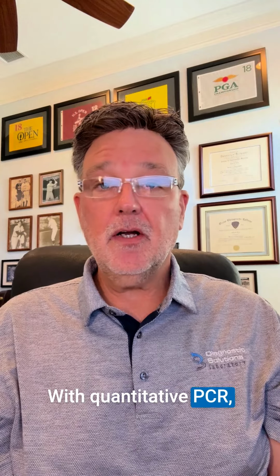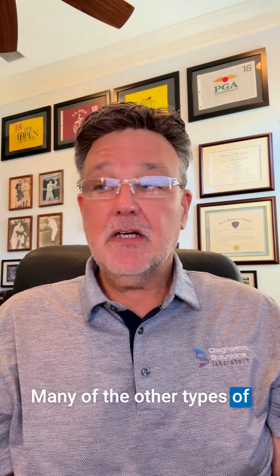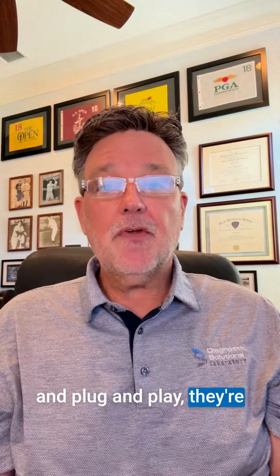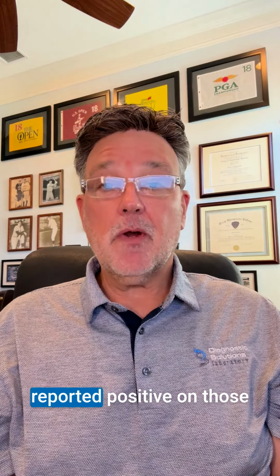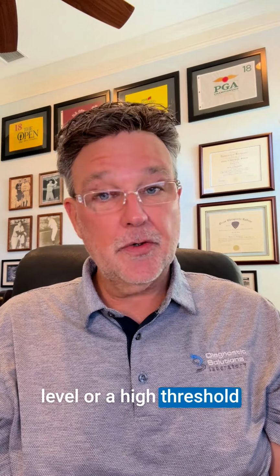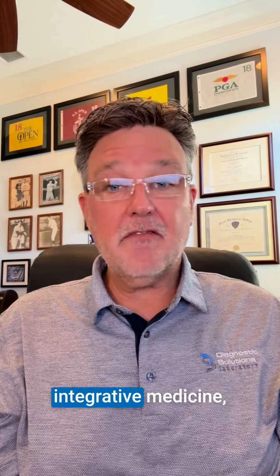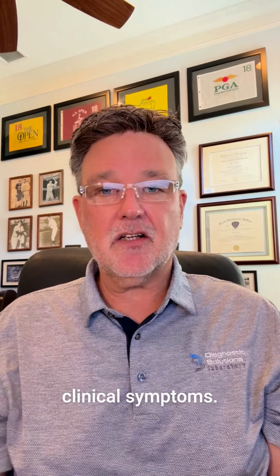With quantitative PCR, we find low levels of organisms and we choose to report them. Many of the other types of tests you may see out there, even some using quantitative PCR, but preformed kits that labs can just buy and plug and play, are only reported as positive or negative on an organism. And an organism to be reported positive on those kits has to be at a very high level or a high threshold that they agreed upon to get FDA approval for it, because the level has to be consistent with disease. But in functional and integrative medicine, we're not only concerned with disease, we're concerned with all the shades of gray getting to disease and clinical symptoms.